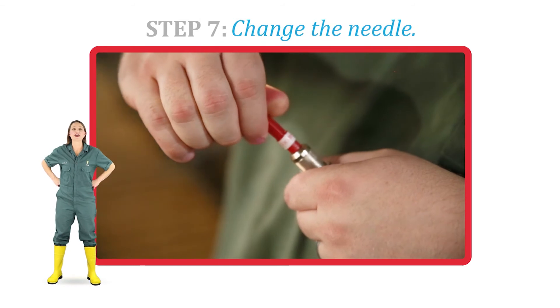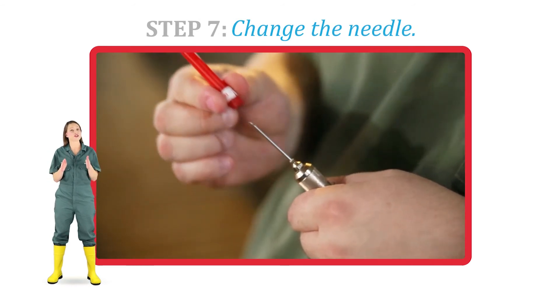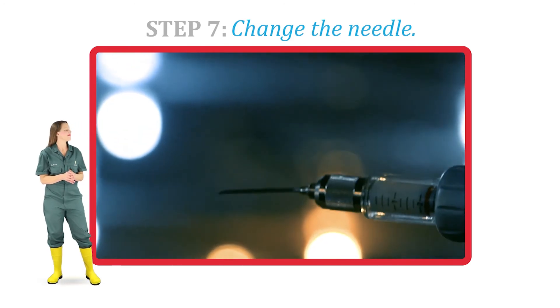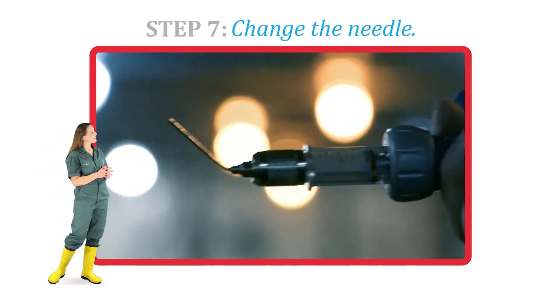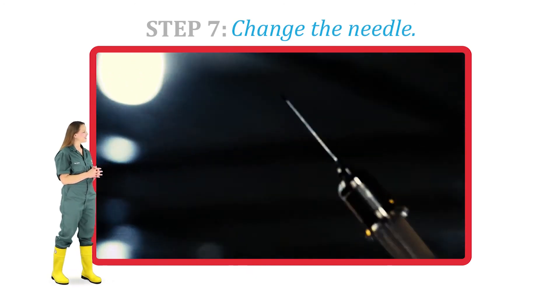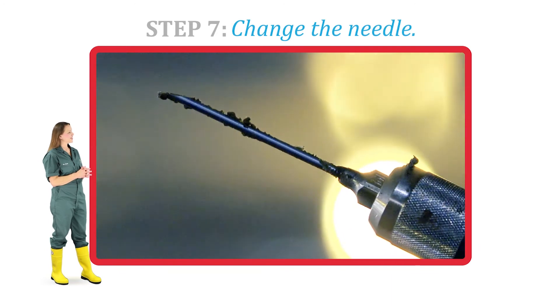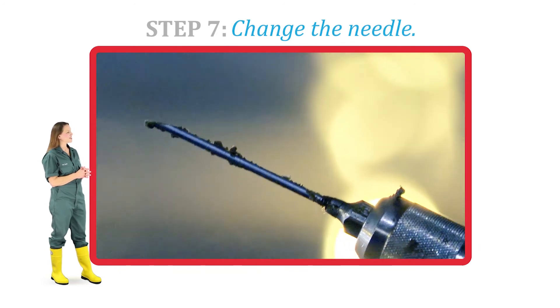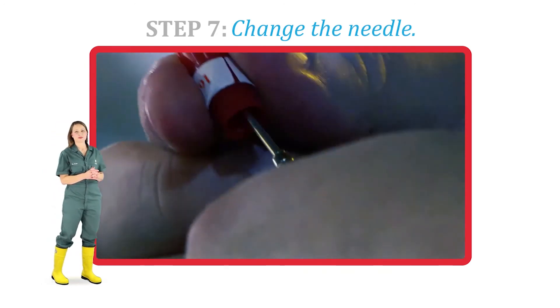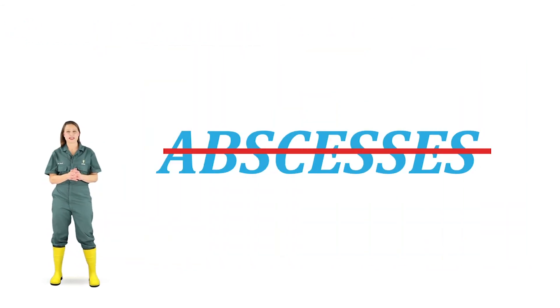Step 7. Change the needle when appropriate to maintain cleanliness and sharpness. Never straighten or reuse a bent needle — always discard and replace it. In addition, avoid using needles with burrs or needles that are dirty, as these can increase the risk of infection or abscesses. Always use clean, sharp needles to inject our pigs.